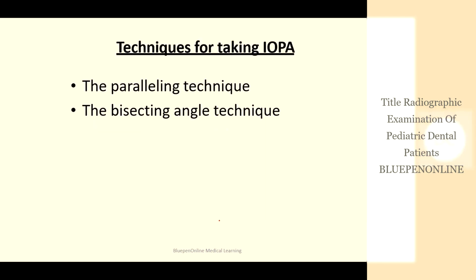Now, how do we take the intraoral periapical radiograph? The commonly used methods involve the paralleling technique and the bisecting angle method. Questions can be asked from this section.